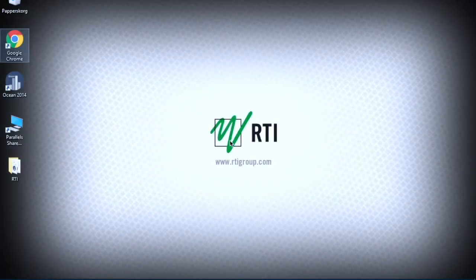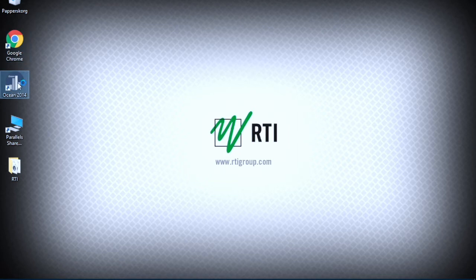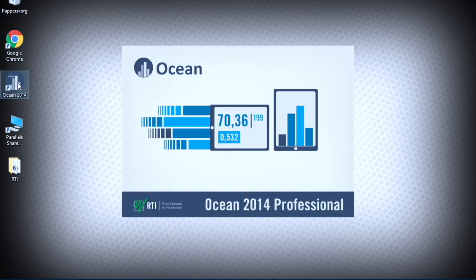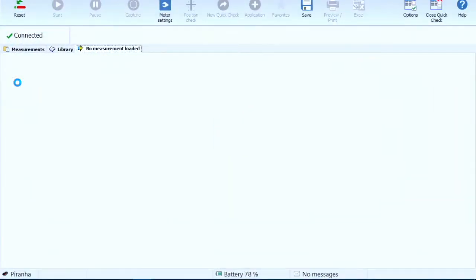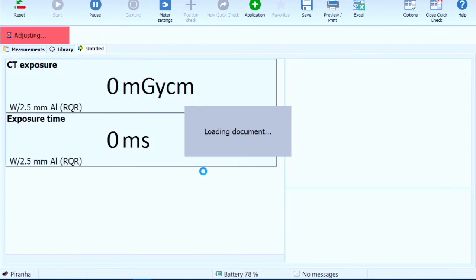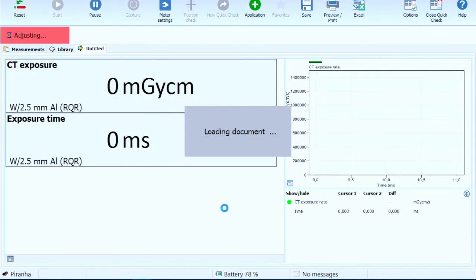Start Ocean by clicking the icon. Ocean will automatically connect to the piranha. Thanks to its plug and play function, Ocean immediately starts to adapt to the optimal settings for measuring with the ion chamber.